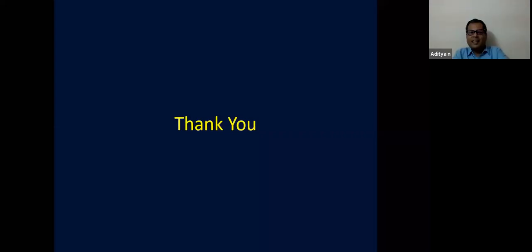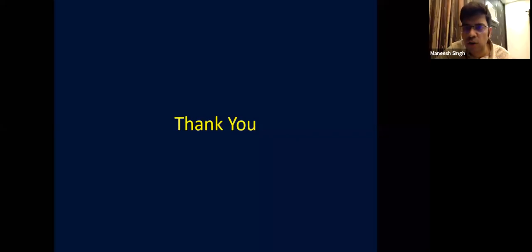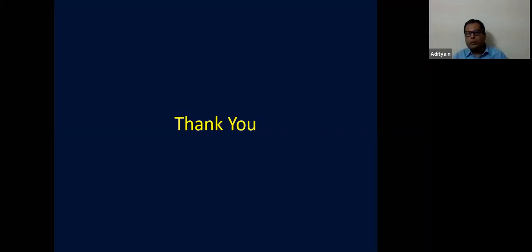This iPad perimetry has been recently developed in Australia, but recently they got permission in India also. It's being marketed recently, the Melbourne Rapid Field. May not necessarily be for treating, but at least you can do a good screening, or when the patient cannot do a formal field if they are not well or something. So those are things.